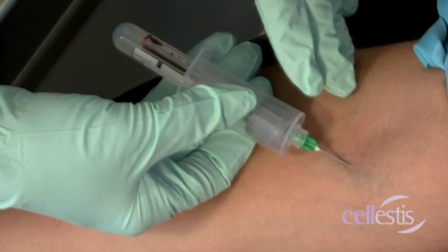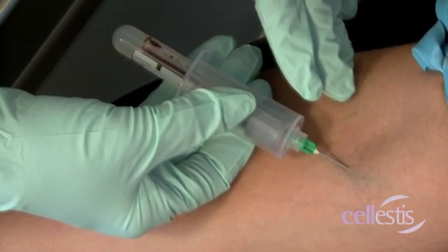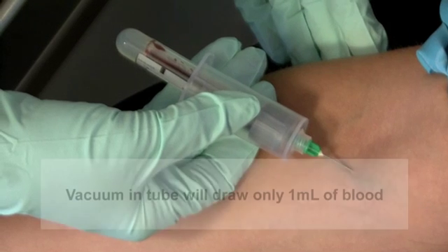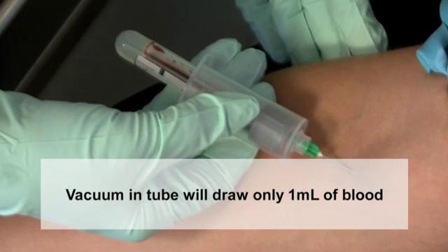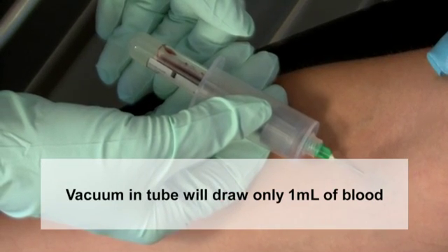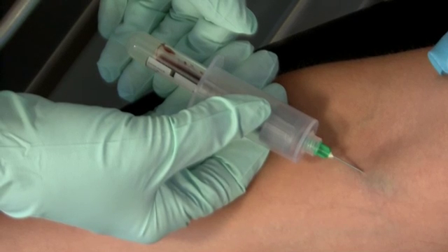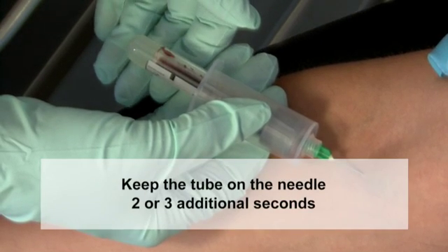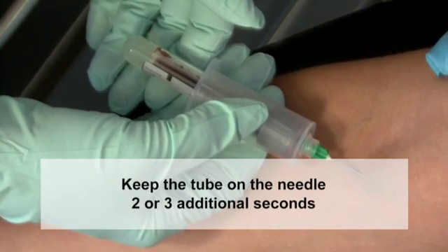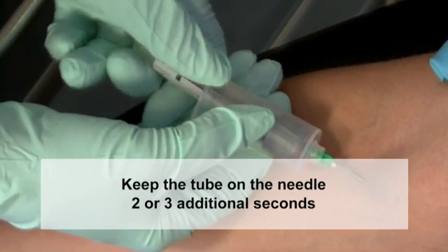Collect one milliliter of blood via standard venipuncture directly into each of the blood collection tubes. It is important to note that the QFT tubes draw blood relatively slowly. The vacuum in the tubes is such that the tubes will draw only one milliliter of blood. Keep the tube on the needle for two to three seconds once the tube appears to have completely filled to ensure the correct volume is drawn.